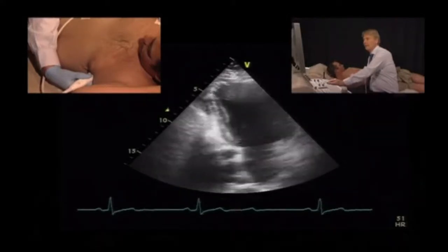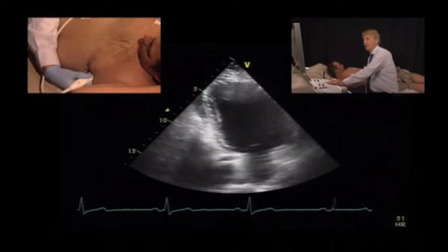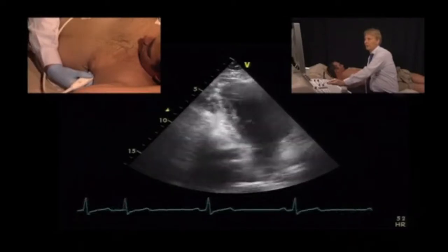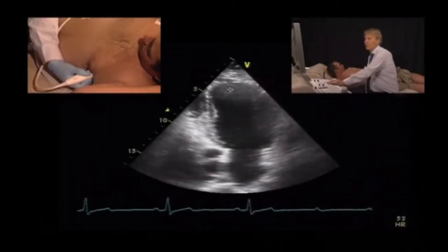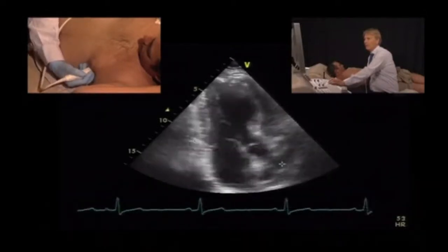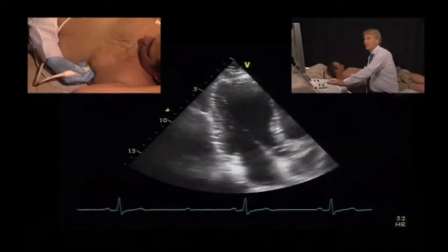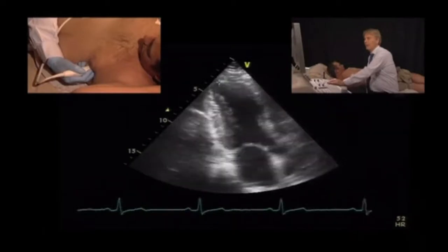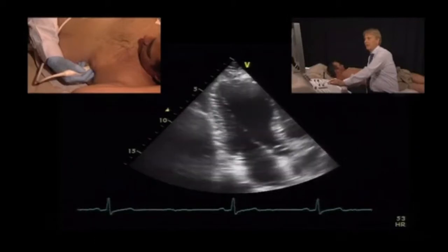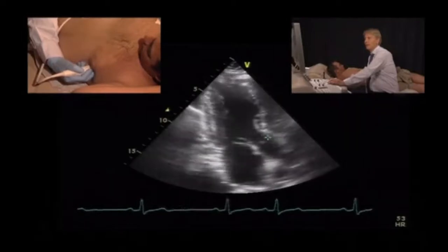This would be the hinge point here. You see you have normal myocardium and scarred myocardium, and the motion is abruptly discontinued here, and the anterior wall contracts normally. Let's take a look at the apical 3-chamber view. Very similar picture. The apex is involved. We have a thin wall here. We have akinesia, dyskinesia here, and normal contraction of the posterolateral wall and of the remaining portions of the anterior septum.